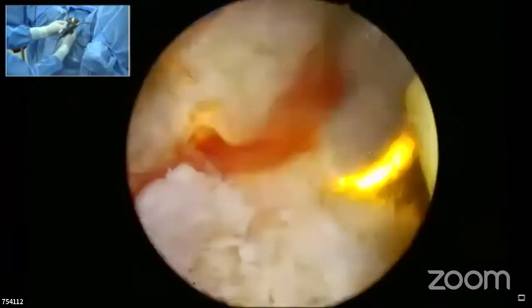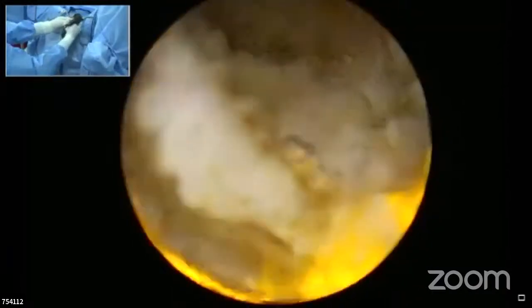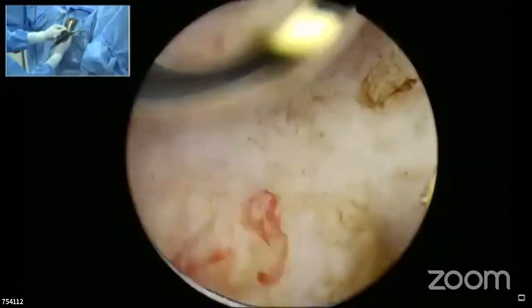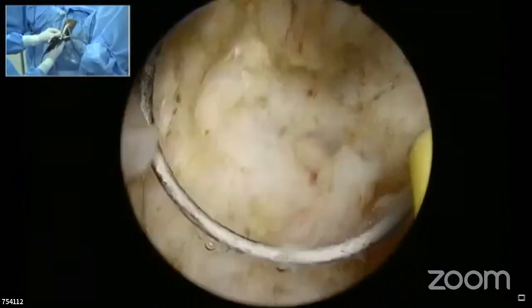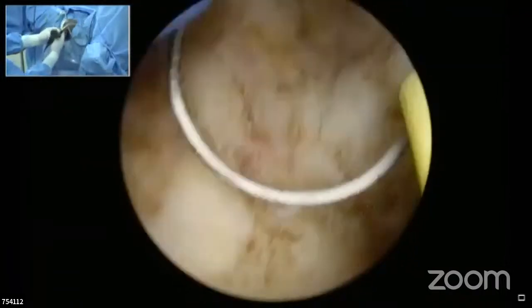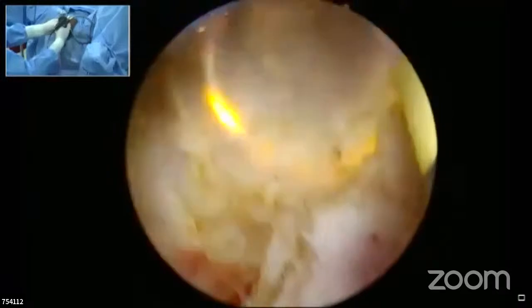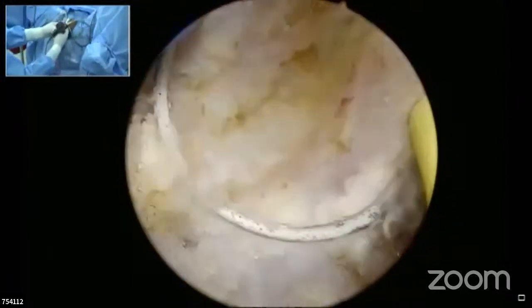We will have to coagulate as much as possible. If it is not settling down, then you cannot coagulate a sinus. I meant the adjacent tissues where the bleeder is. Another salvaging technique would be to lift a flap of tissue just distal to it and place it over it, and a sealing, soldering kind of effect can be done. That tends to bail you out on a few occasions. So it acts as creating a flap of tissue fixated over the opening of the sinus.